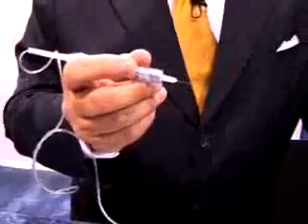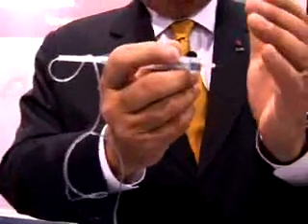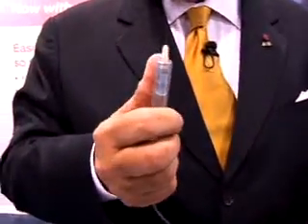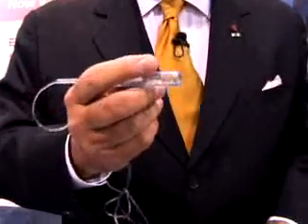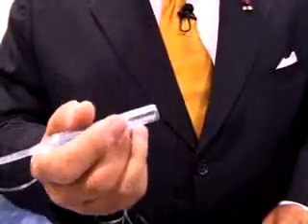The safety wand has been developed to comply with OSHA regulations concerning engineered sharps. And when this is in the mouth, the needle can be retracted even before it leaves the mouth. But in dentistry, we use multiple injections. So with one hand, we can project the needle and give another injection. We can protract and retract the needle as often as needed. This complies with all the OSHA regulations in that we can use it in a one-handed manner.